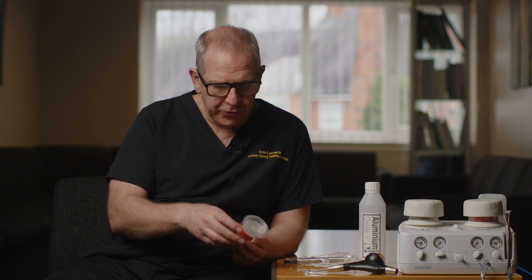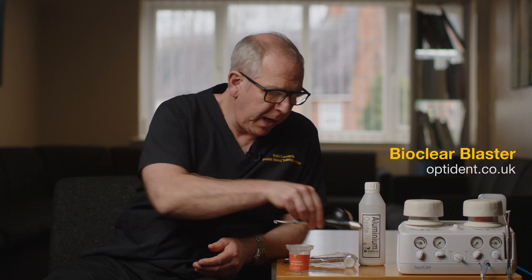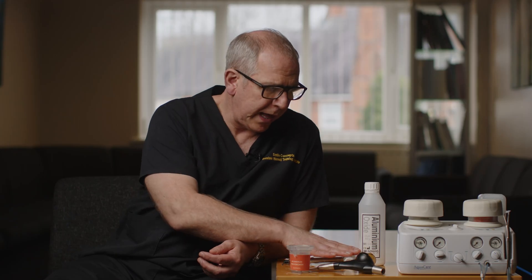Your other option is aluminium trihydroxide, which has to be used wet. The system I recommend for that is the BioClear blaster. The problem with the BioClear blaster is purely cost - it's substantially more expensive than the Optident unit. However, a blaster similar to it is also available through Optident's website. That wet system works with aluminium trihydroxide, while the other works with aluminium oxide.